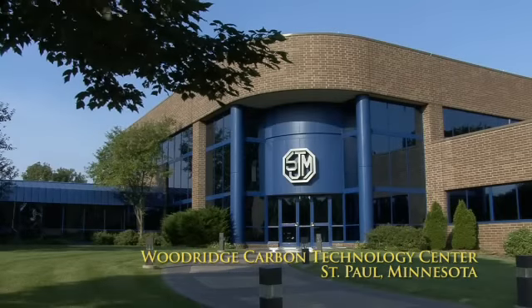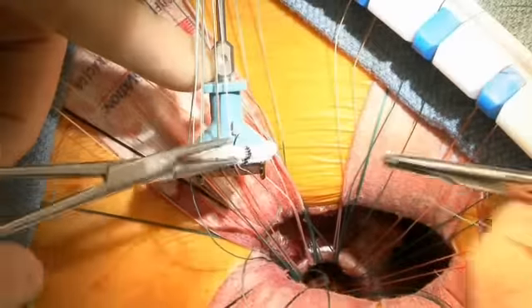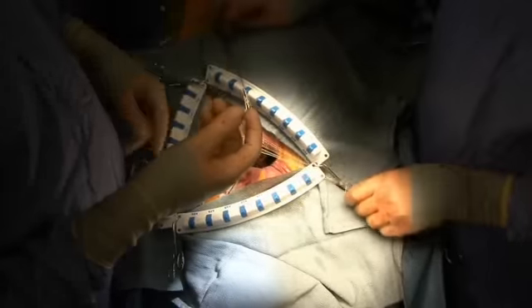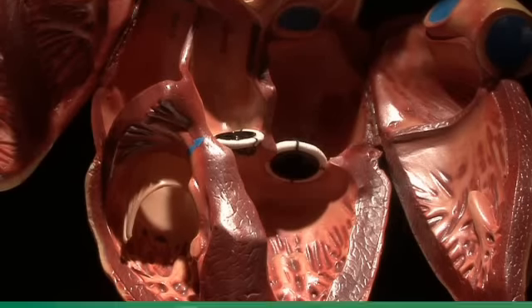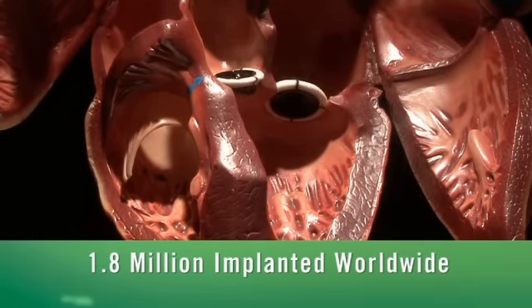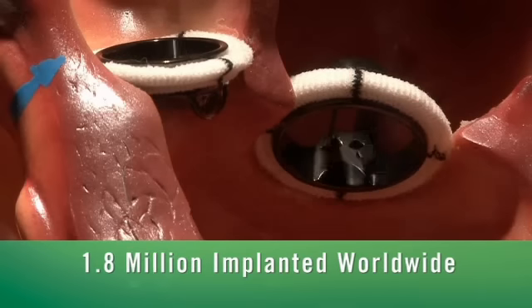Welcome to St. Jude Medical's mechanical heart valve operations in St. Paul, Minnesota. Since the first implant 30 years ago by Dr. Dmitri Nikolov, surgeons have implanted more than 1.8 million St. Jude Medical mechanical heart valves worldwide. That is over 1 million implants more than any other mechanical valve manufacturer.